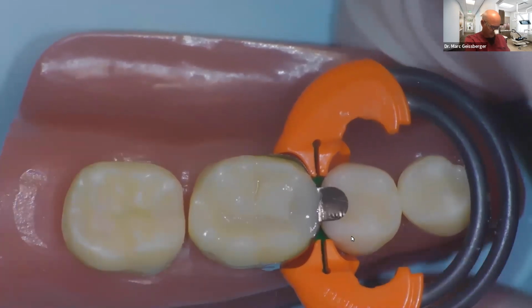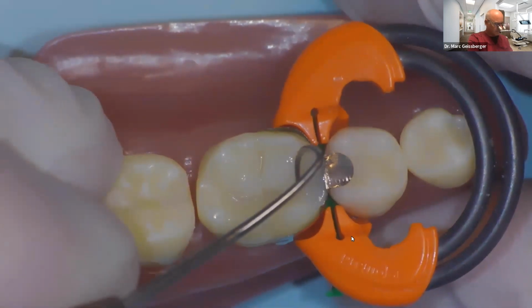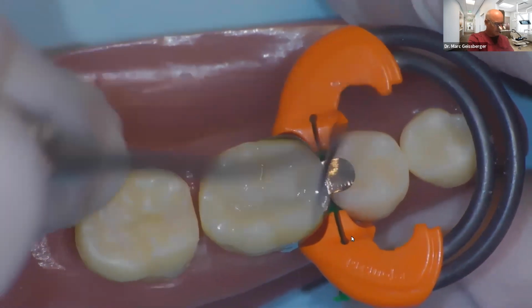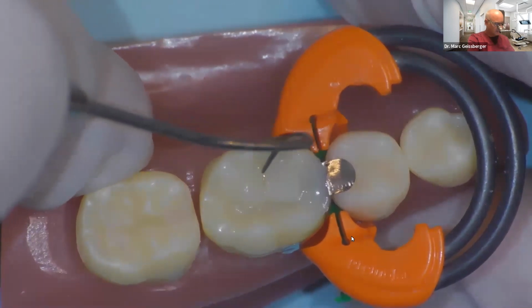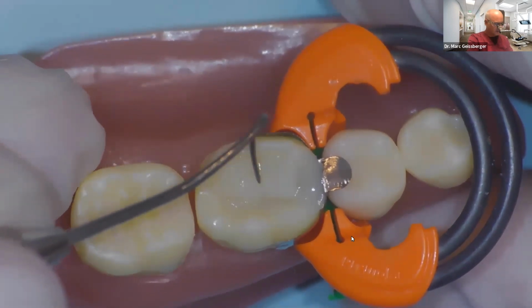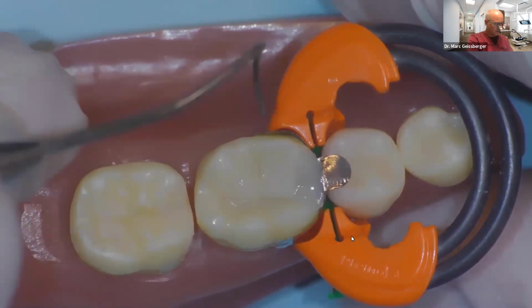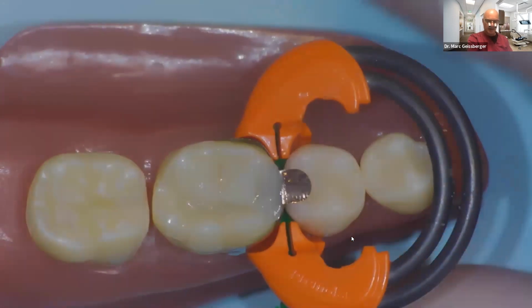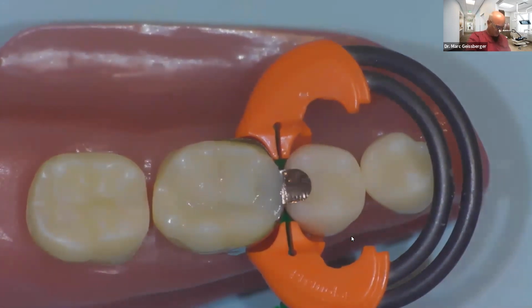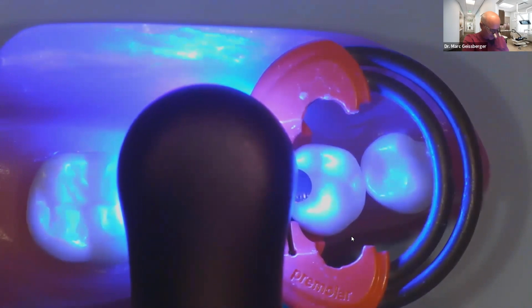So we place that. Then what I'm going to do is take my Explorer tip, come in here, form a mesial fossa, reestablish my lingual groove. There. Make sure I got a nice defined mesial fossa. And then we light cure here. Okay, I'm getting this done for you. 5 seconds. Why? Because I'm moving on.